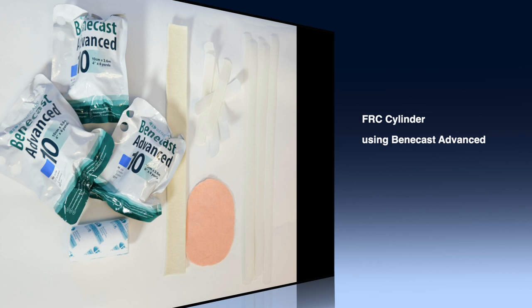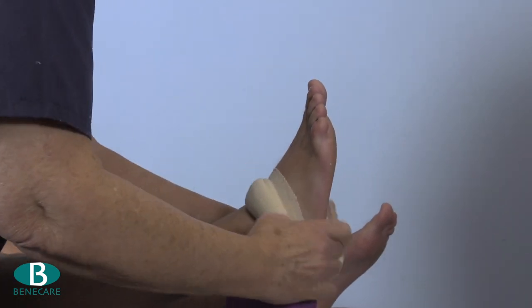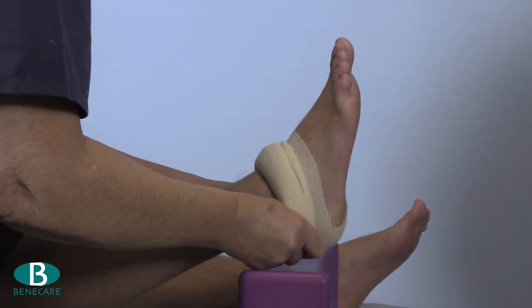Today I am demonstrating the application of a cylinder cast to the leg with Benecast Advanced using an FRC technique. I have placed the limb on a block to maintain the position of the knee in extension.